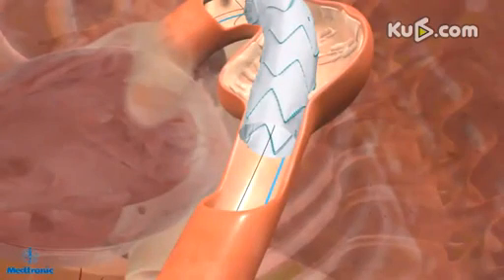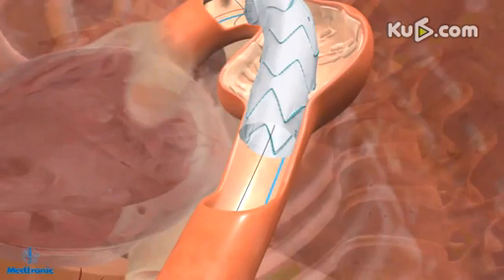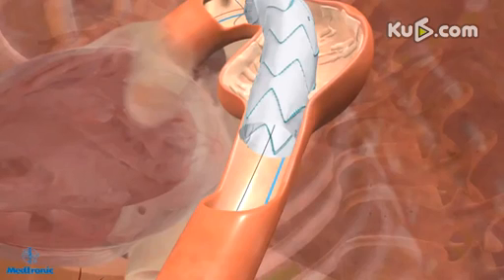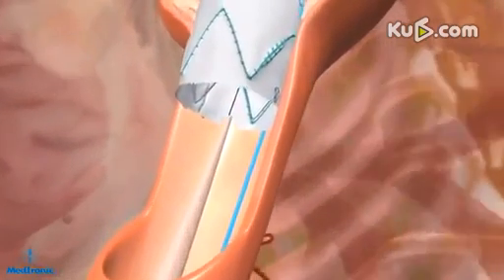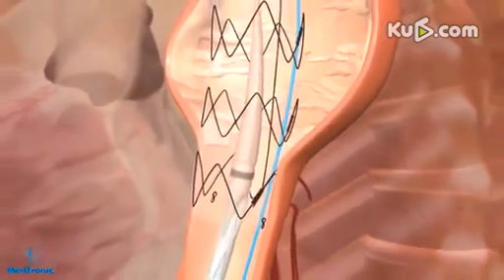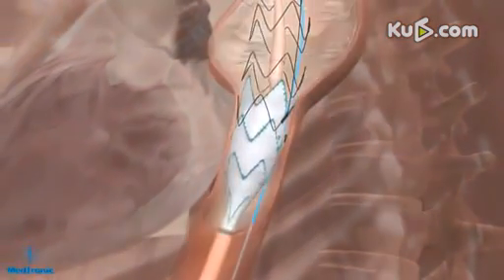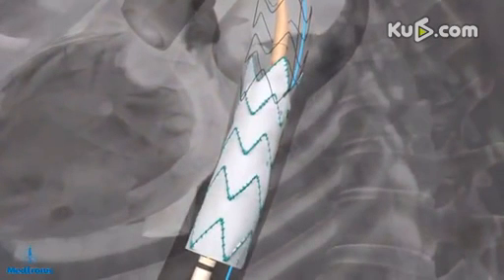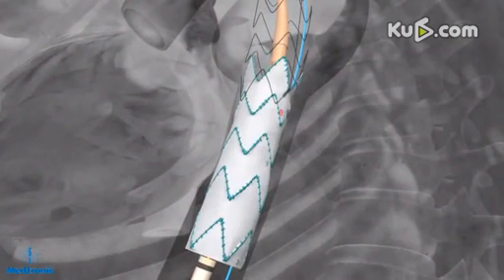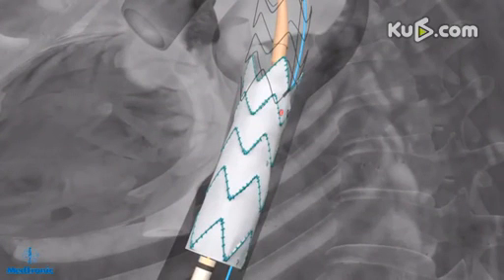At times, it may be necessary to implant additional devices to completely exclude the aneurysm. If additional devices are needed, prepare the second device using the same steps described in the instructions for use. Slowly advance the Talent Thoracic StentGraft system to the targeted landing zone, monitoring advancement of the device within the previously implanted stent graft under fluoroscopy to ensure that the implanted stent graft does not move. When placing a distal main section, verify that the proximal figure-eight radio-opaque markers are aligned with or located proximal to the distal figure-eight markers of the mating graft.